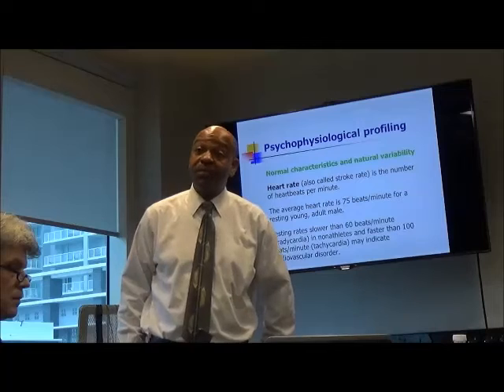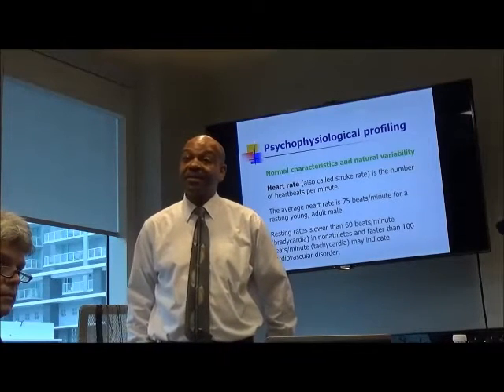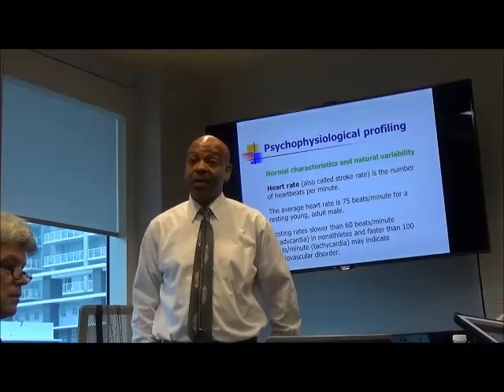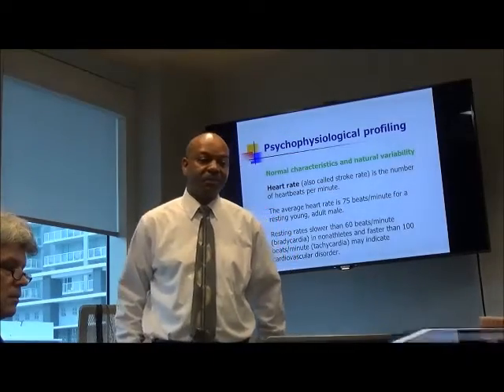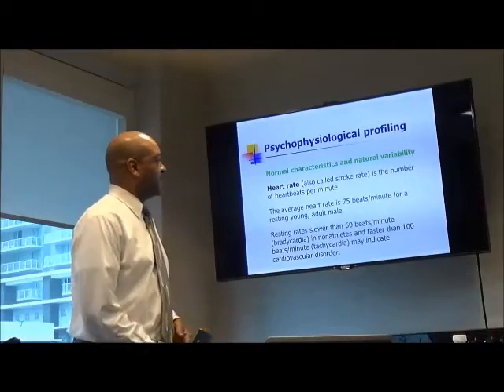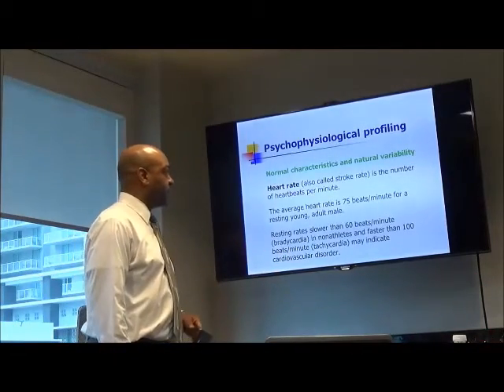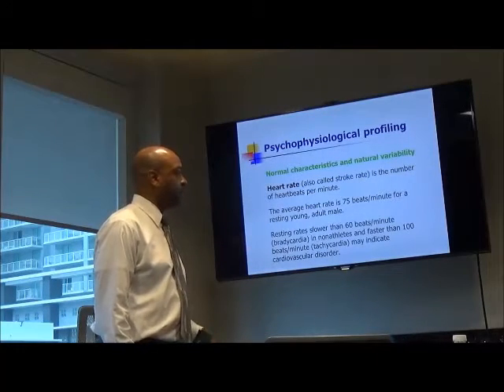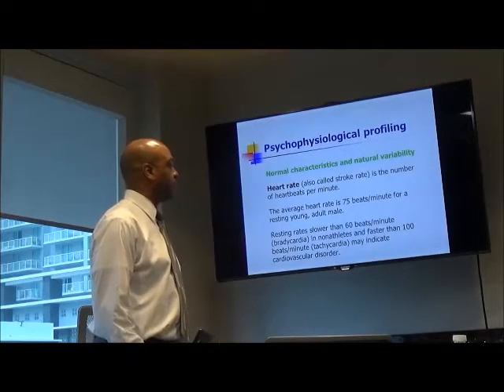So it went from 1 to 50? No, he went from 50 to 120. Up to 120? Yeah. Wow. That's amazing. Then you have heart rate, and it talks about some of the readings for heart rate to look for.